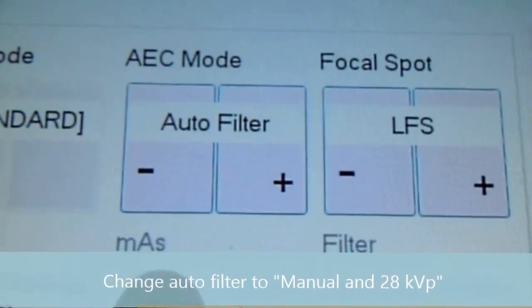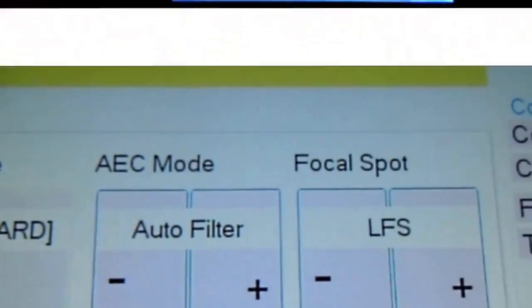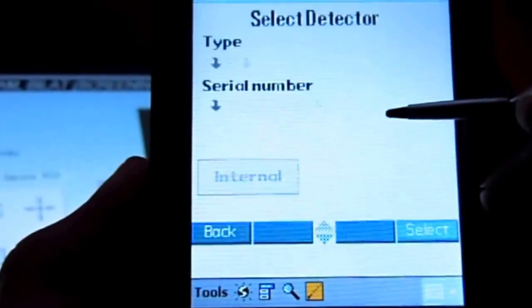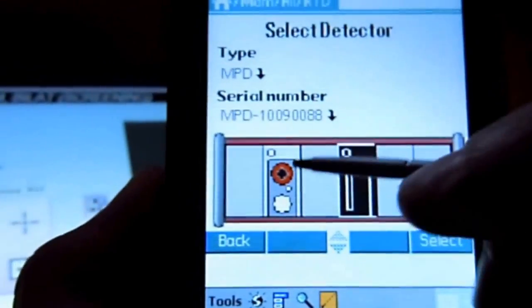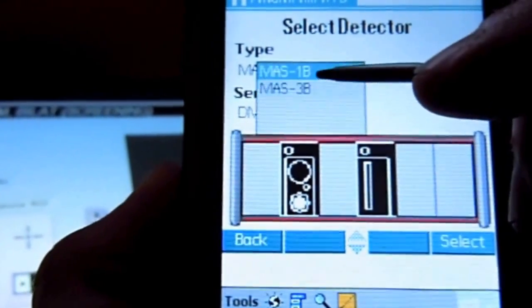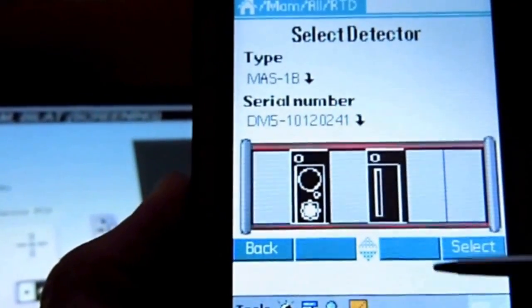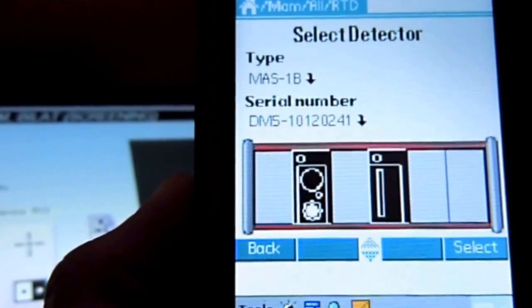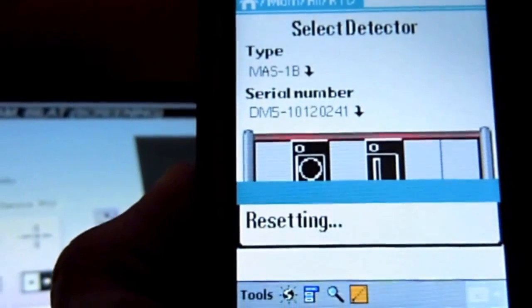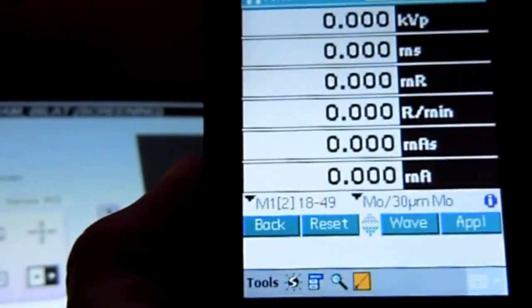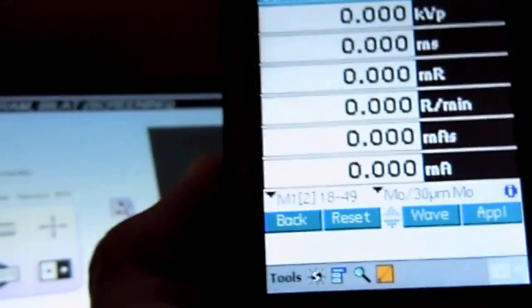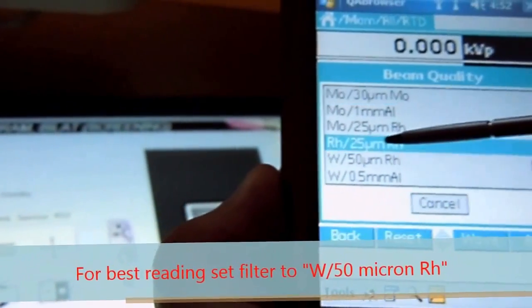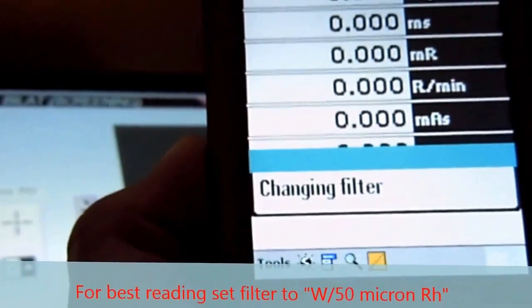We have auto filter, large focal spot, select the detector, select 1B. Change the filter to RH.